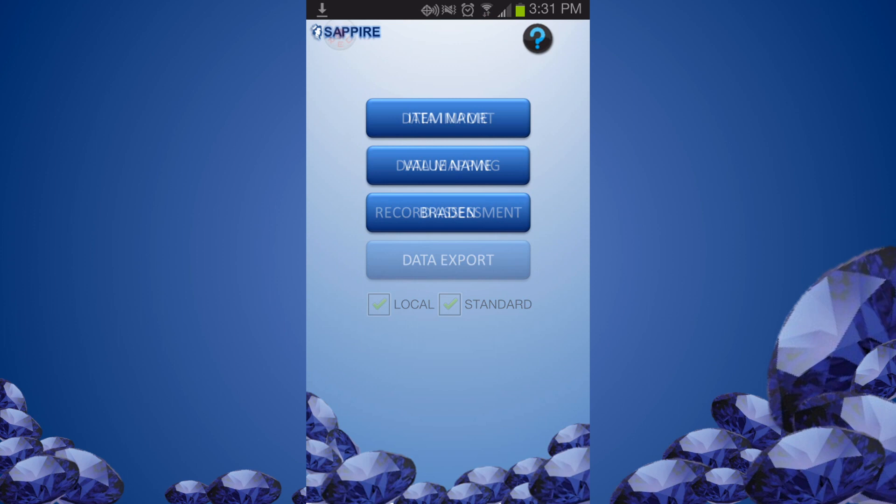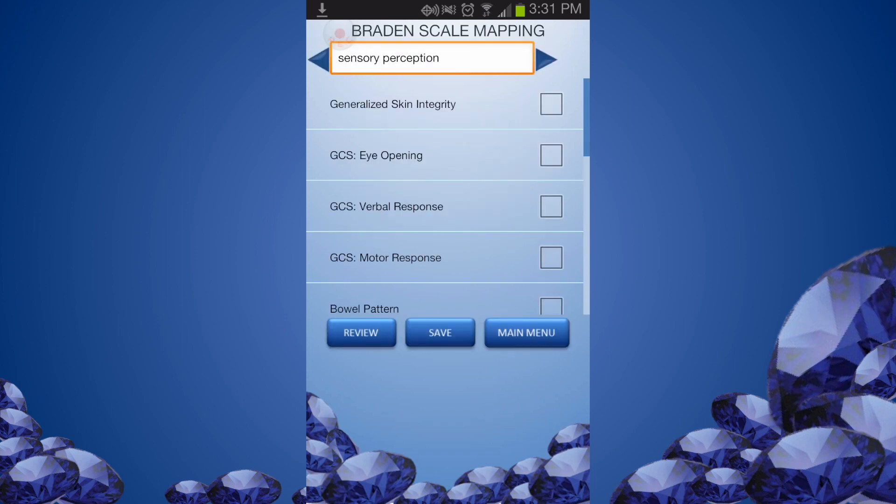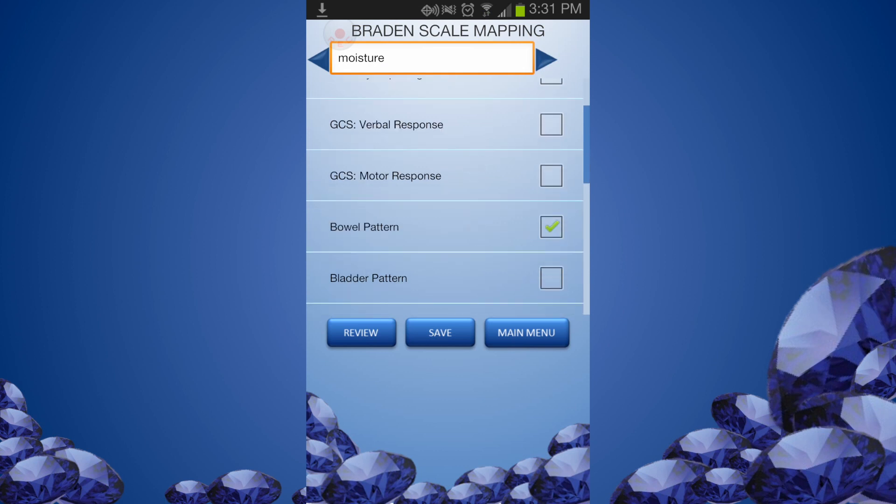From the Data Mapping menu, select Braden. The Braden scale parameter is shown on the top and the imported local assessment items are listed below. For the displayed parameter, you first select relevant assessment items and then associate them to the parameter by clicking the Save button.